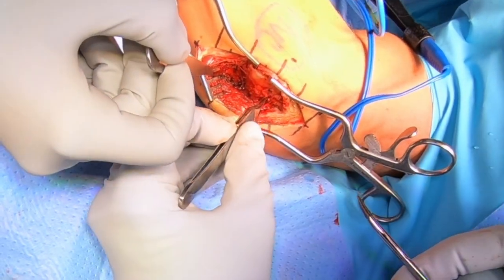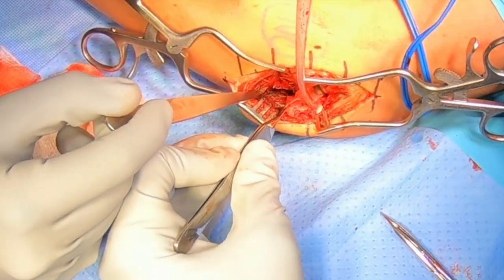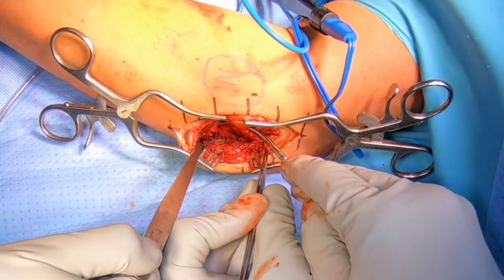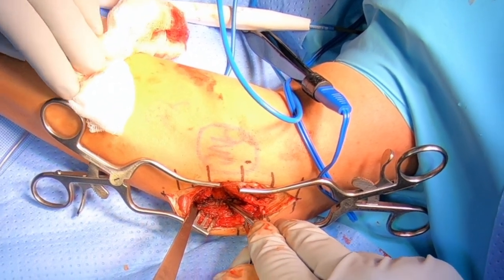Here's the ligament itself, and you can see how lax it is. You can see there's a little hole in it, and this tissue is supposed to be very taut. There's even a little loose body here underneath the ligament that I'm removing. So that tissue is not sufficient to stabilize the elbow, and that's why it keeps dislocating. We're going to need to reconstruct that.